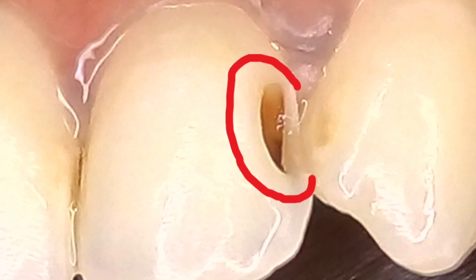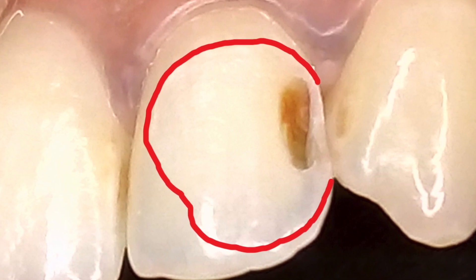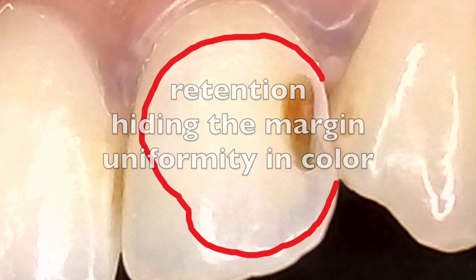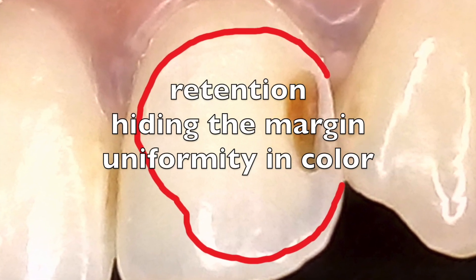The bio clear method requires you to prepare a much wider surface area of enamel to create the appearance of a wide saucer instead of a slot. The enamel extensions are helpful in retention, hiding the margins of the cavity, and in obtaining a uniform color.